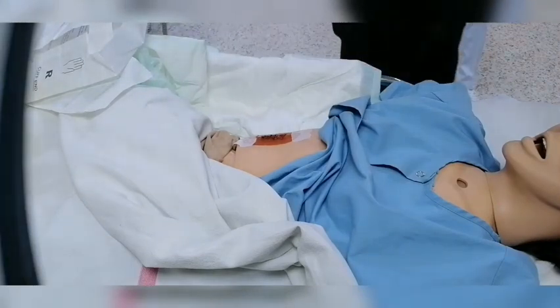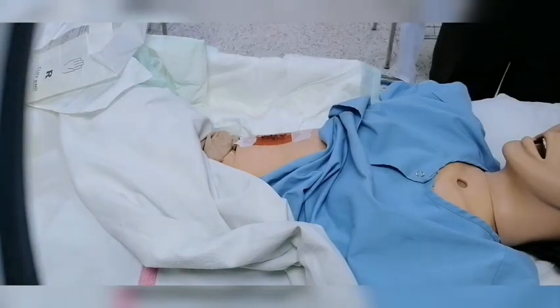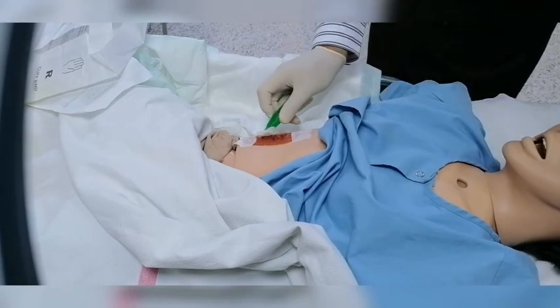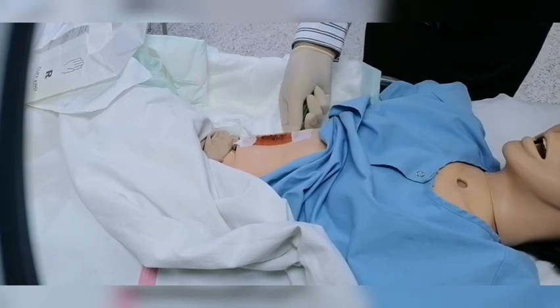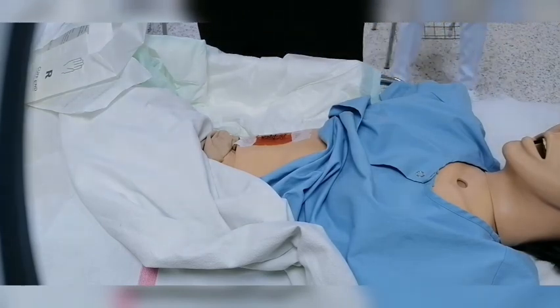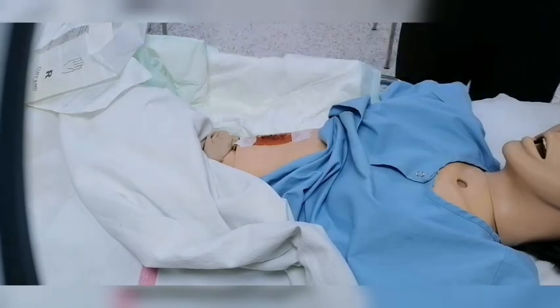If any fluid is coming out to the skin, I have to clean it properly, away from the skin. Then I have to dry it.